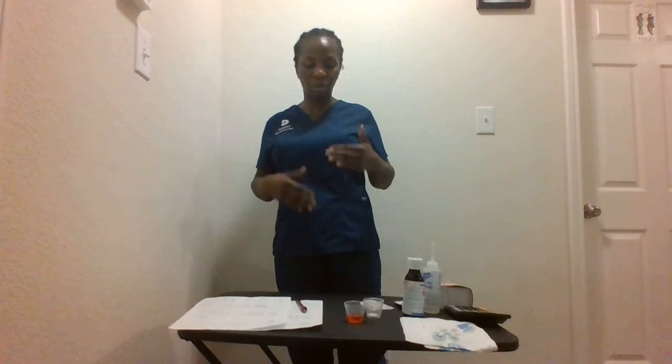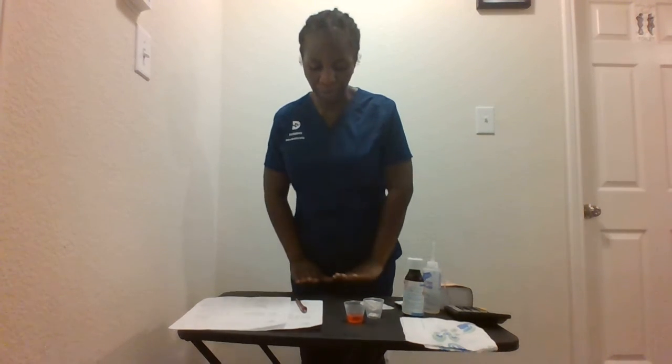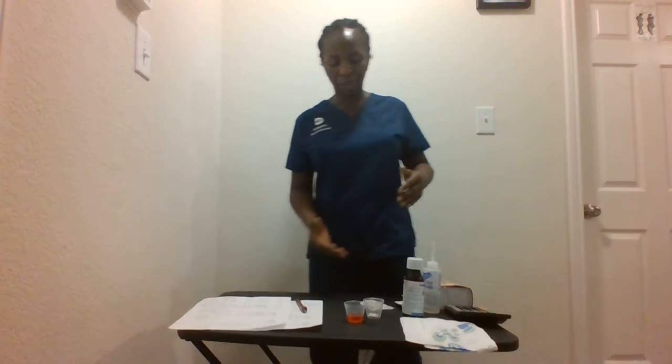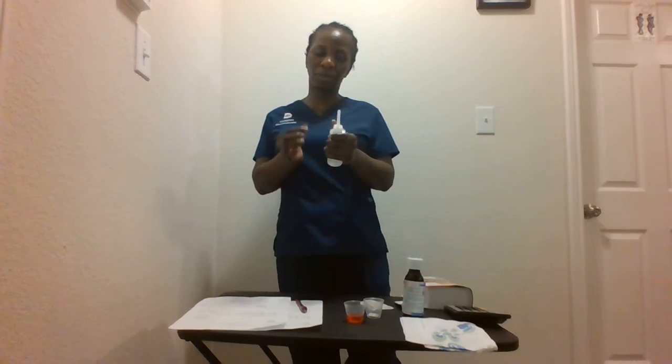And when I'm ready to administer, to insert the tubing into the anus, I'll pull down the side which I'm going to work with, maybe the right side. Then I'll have my patient move towards the left side. Then I will locate the buttocks. Then I will lubricate the tube of the enema. I'm just using this for demonstration.